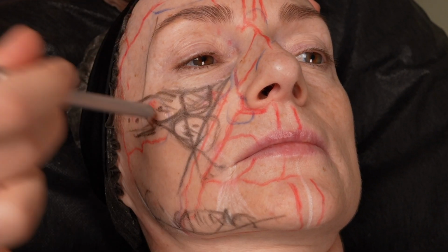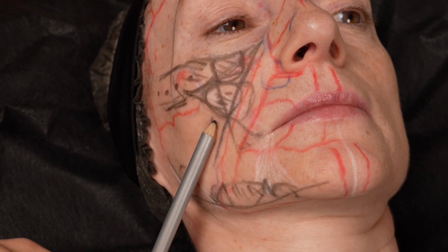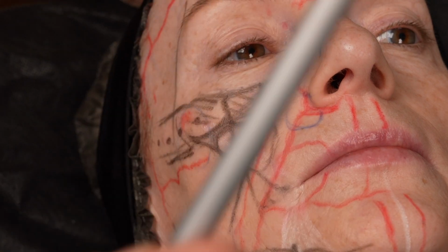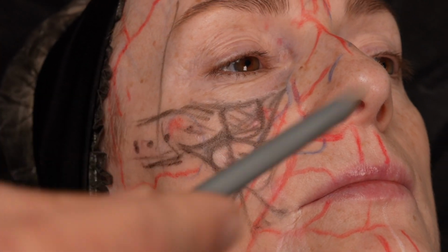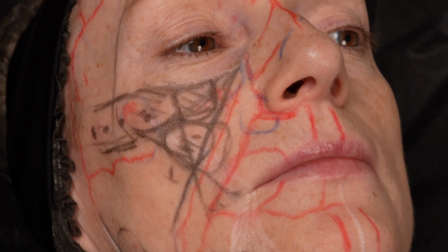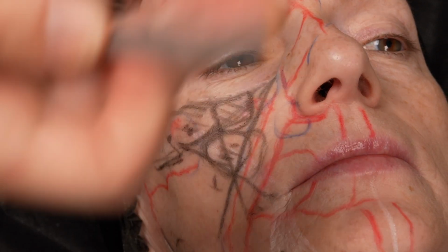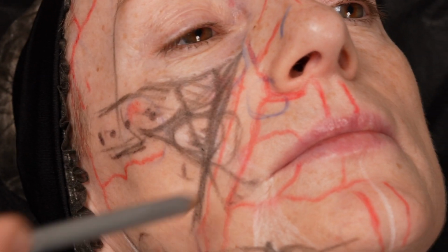Mid-face, I told you, needle is possible, cannula is possible. For example, I can use this entry point, I can reach the medial deep fat, deep medial cheek fat, lateral till zygoma, doesn't matter. You can enter from here, you can go deep fat and inject here, enter from here, you can reach everywhere. The aim is not your entry point, the aim is that you should reach every place with your cannula and just change your layer, then you can inject superficial fat, because this is also the limit of the mid-cheek groove and nasolabial fold.